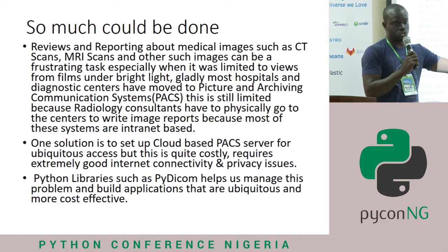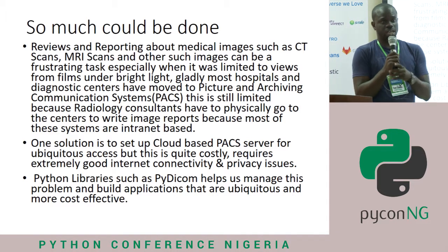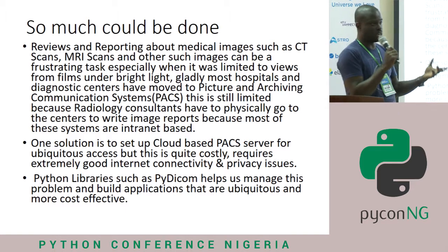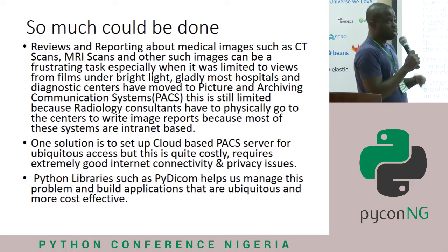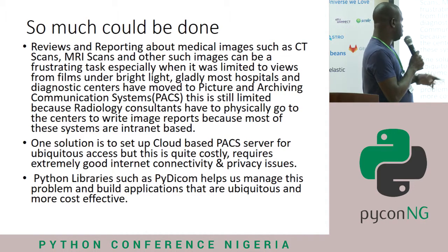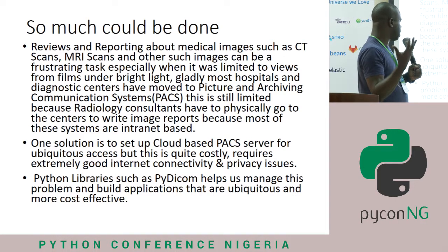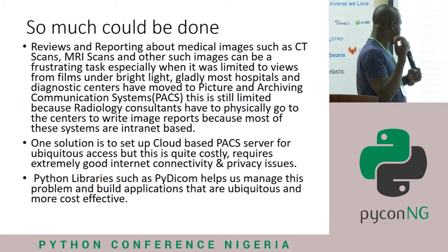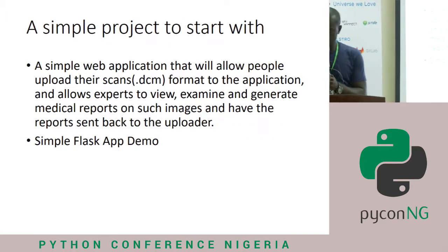And also privacy issues. Hospitals like UCH and a couple of others have issues with keeping their data up in the cloud. So in trying to innovate around that space, PyDICOM comes to help, such that we can build simple apps that help us manage this problem and build applications that are ubiquitous and more cost effective.